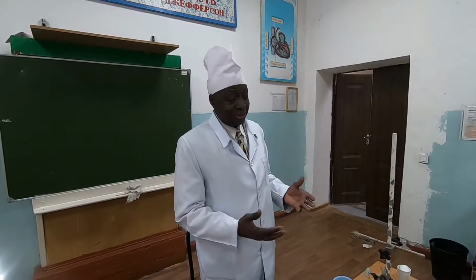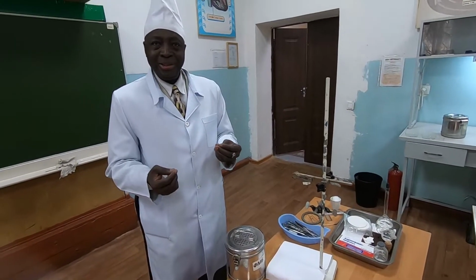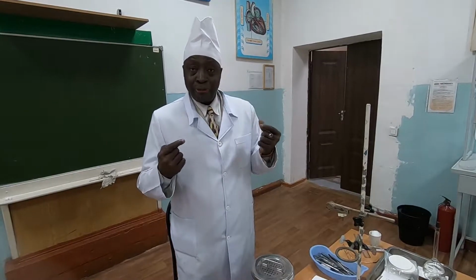And today we're having a special topic. This topic is concerning the endocrine glands. Today, you're going to see for yourselves, and you're going to do it by yourselves with my help, how the effect of adrenaline affects the eyeball of a frog.